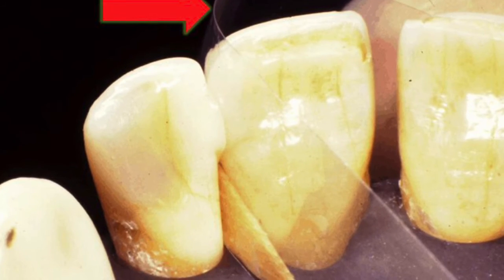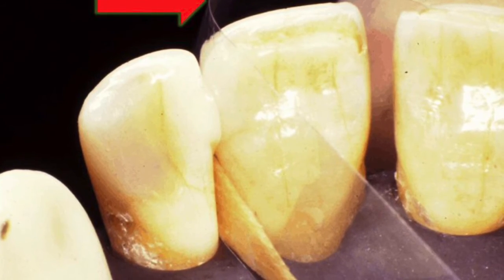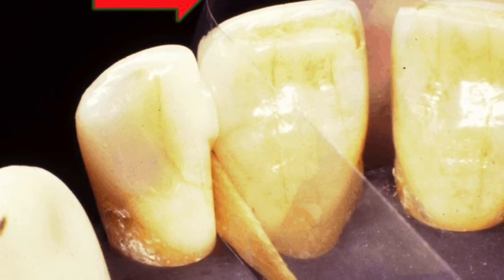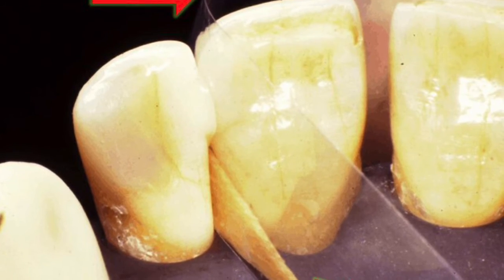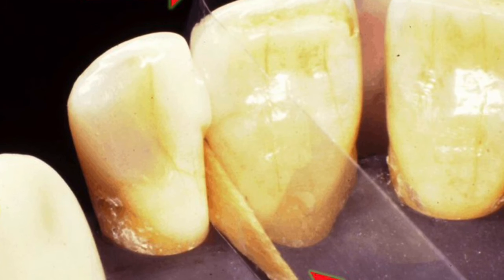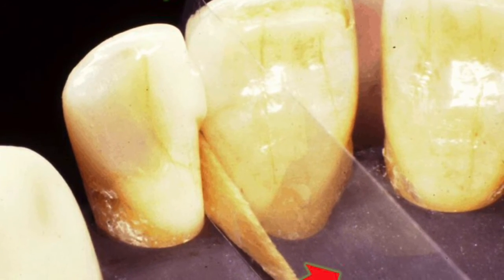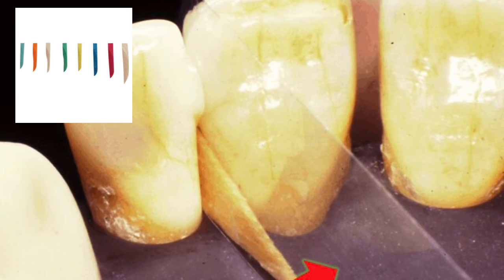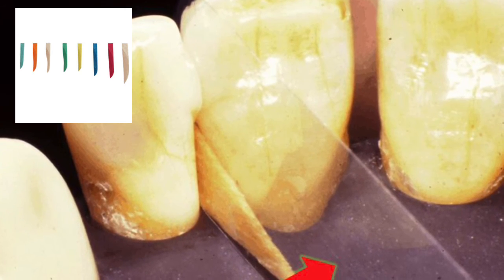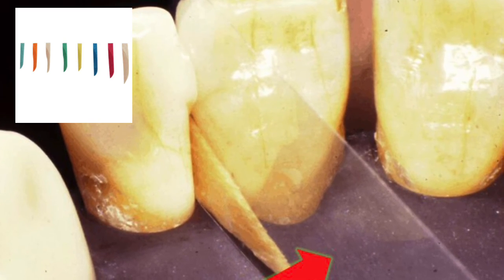When we completed our class 2 amalgam and composite restorations, we utilized the Tofflemire and Garrison matrix system. This system will not be utilized for our class 3 composites. Instead, we will use the Mylar strip secured by a wooden wedge like the photo above. To note in this photo, that is not a pre-contoured wooden wedge. The photo attached shows contoured wedges that we promote using for this restoration.